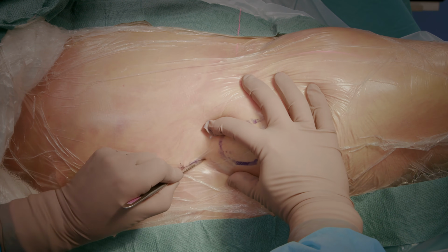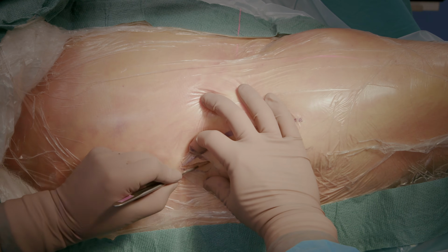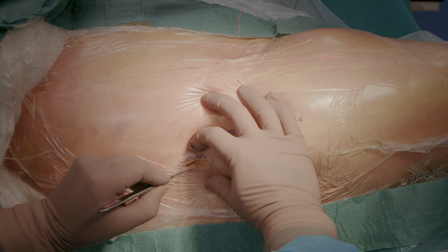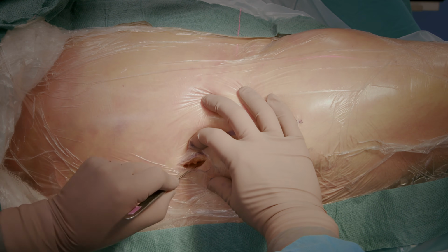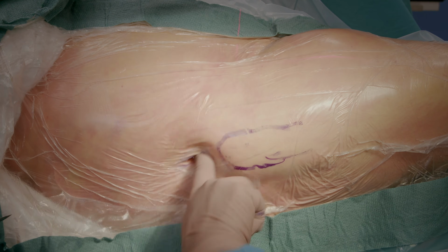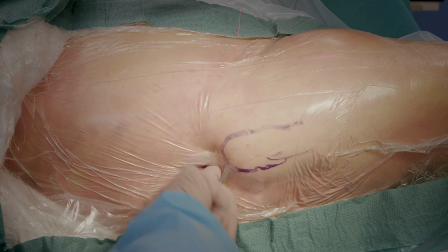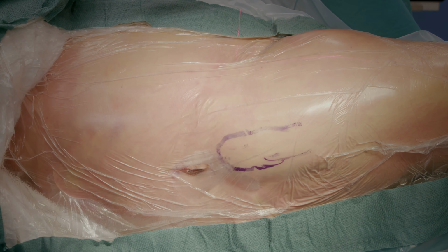Here, when approaching laterally and from a proximal direction to the tip of the greater trochanter, there are no critical anatomical structures just below the skin incision. You can proceed to the fascia with a blade and check by palpation that you're at the correct level. Then we take a retractor.